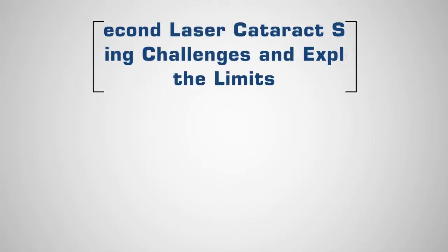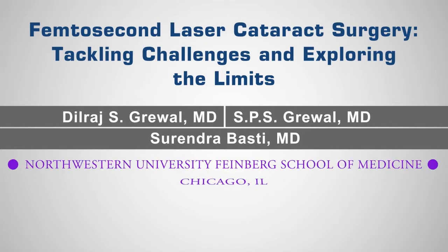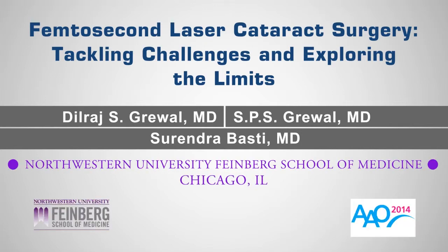In this video, we present tackling challenges and exploring the limits with femtosecond laser cataract surgery.